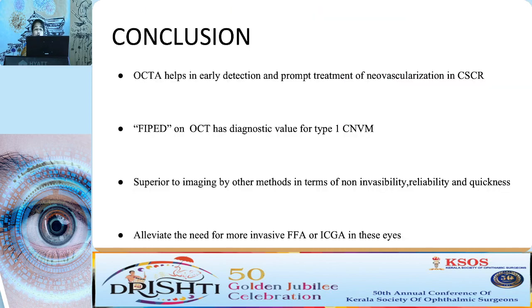So to conclude, OCTA helps in early detection and prompt treatment of neovascularization in CSCR. FIPED is a very important diagnostic marker. This imaging modality is superior to other methods in terms of non-invasiveness, reliability, and quickness.